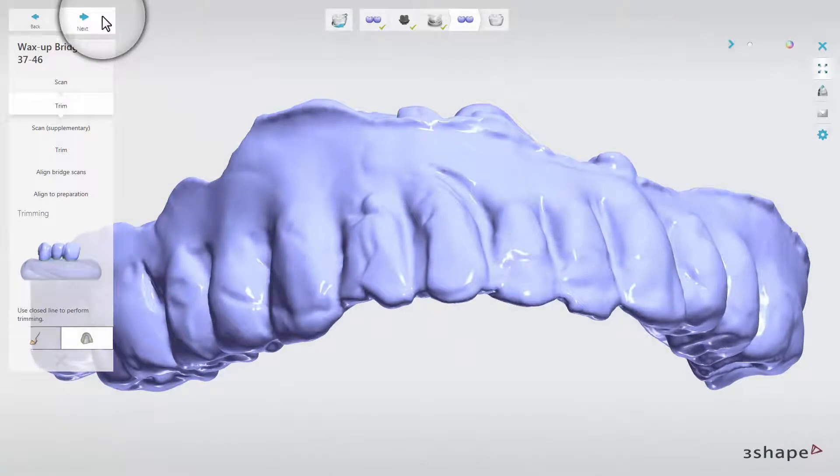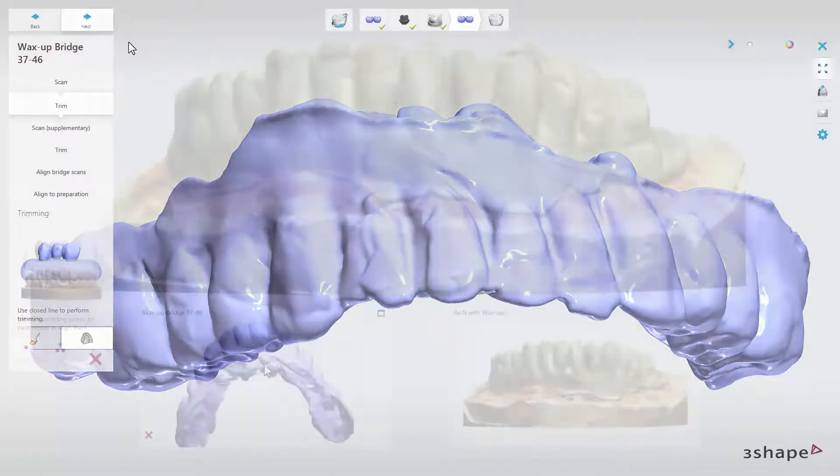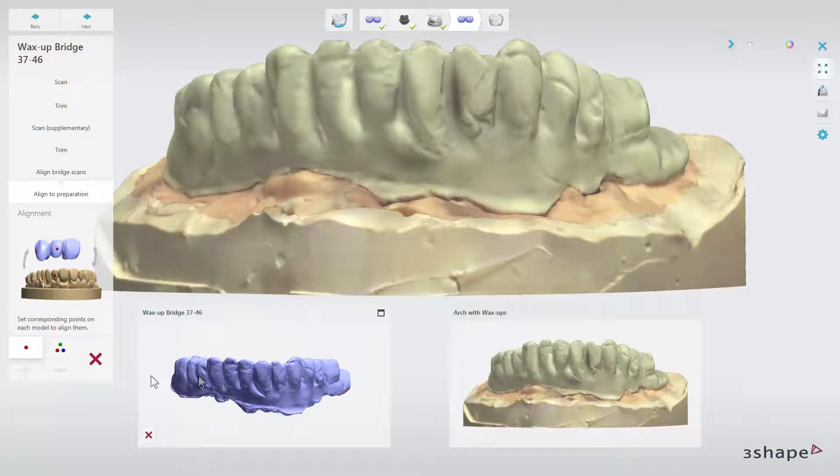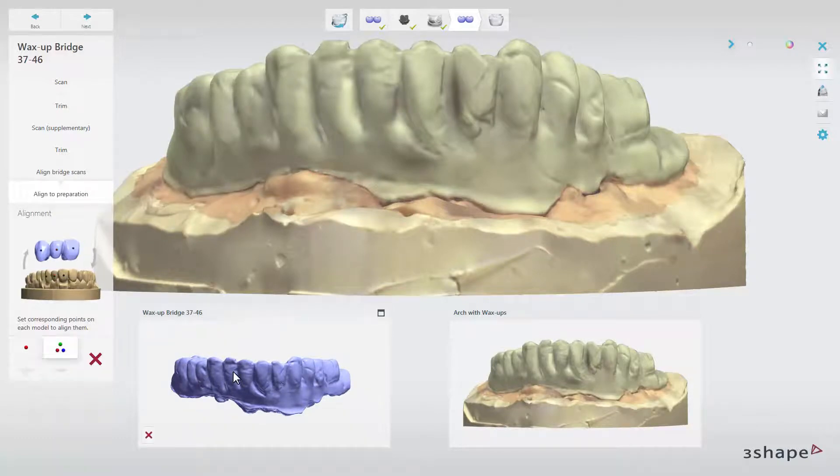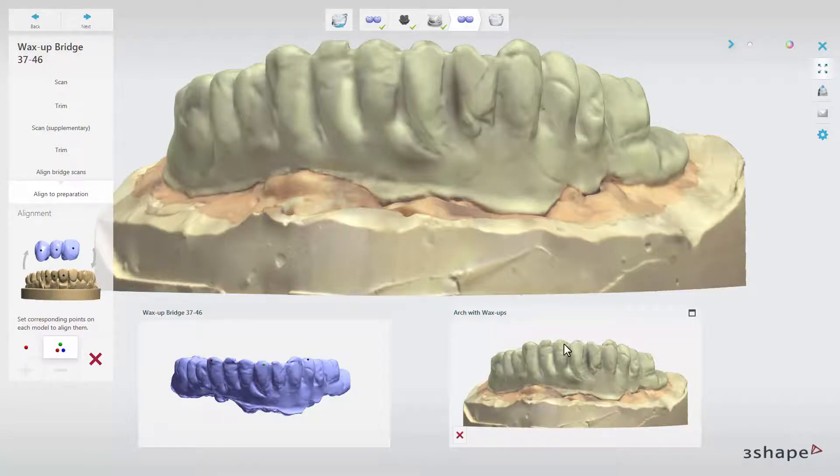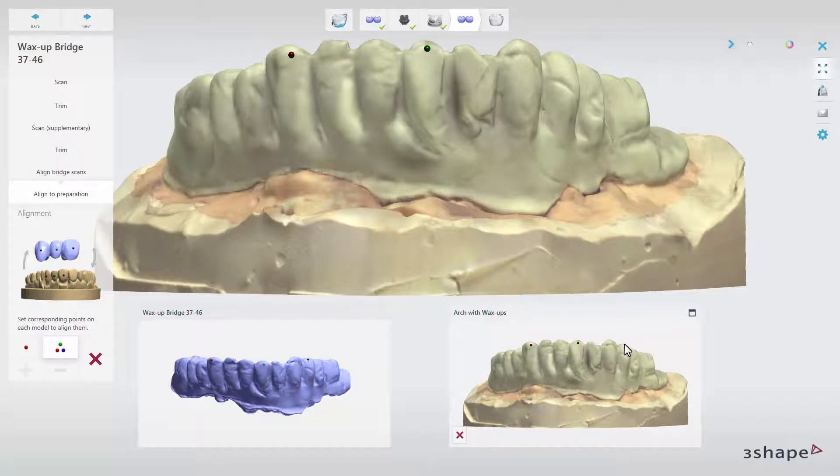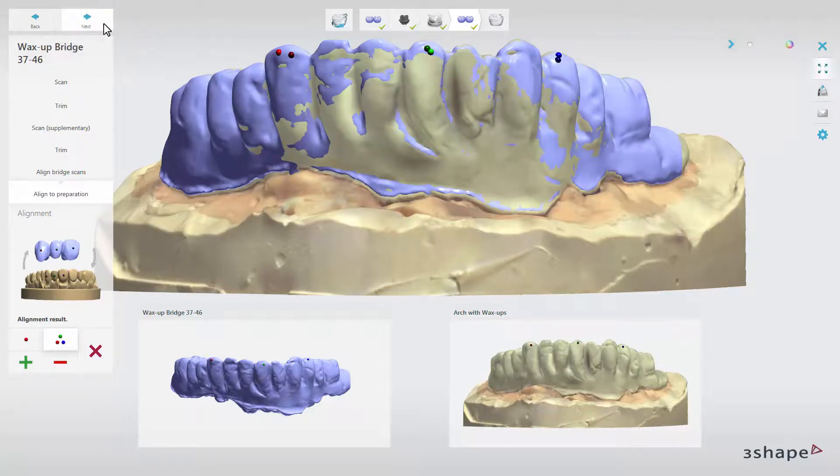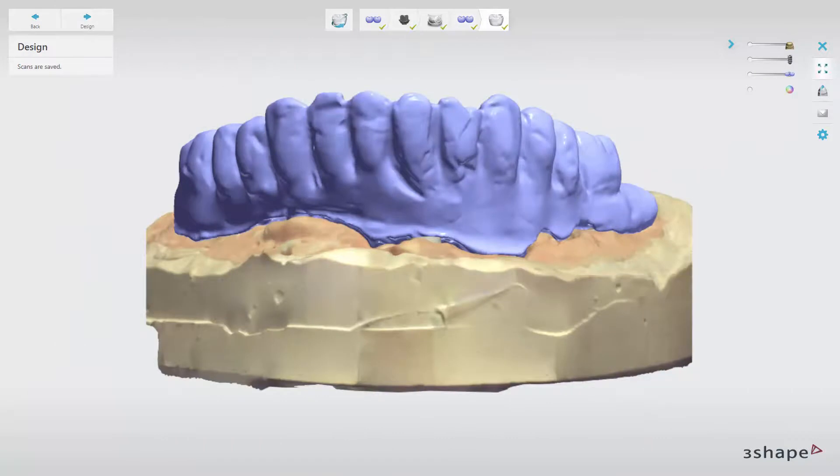The last sub-step in this stage is to align the wax up to the Preparation scan. We recommend using the three-point alignment to get better precision for this procedure. By clicking Next, you'll be moved to the last step, Design, in which your scans will be saved.